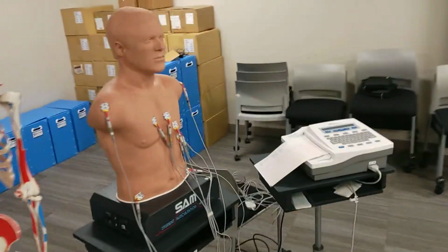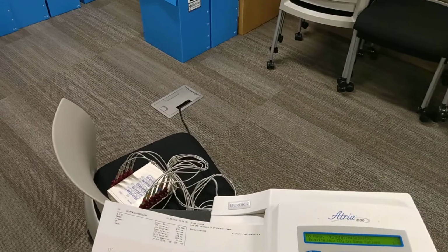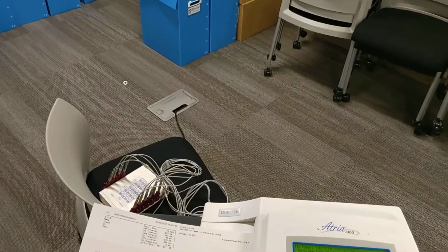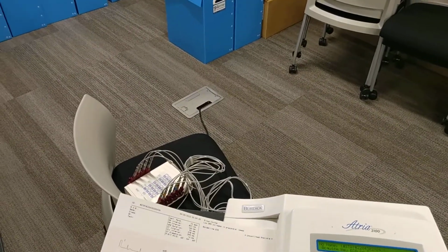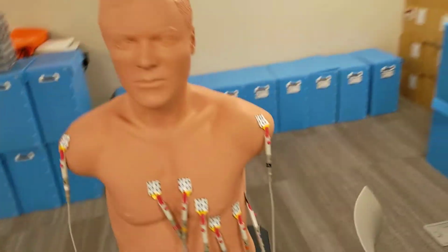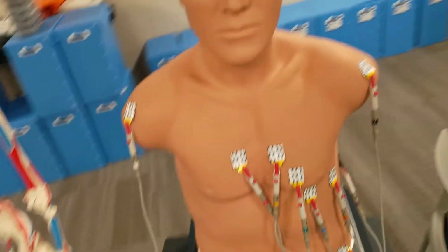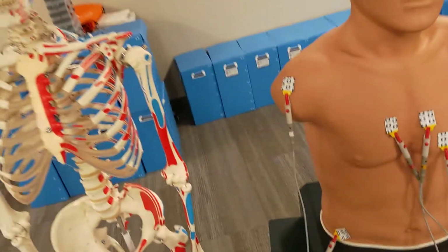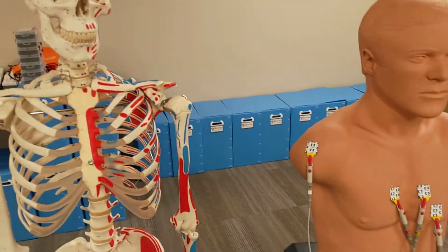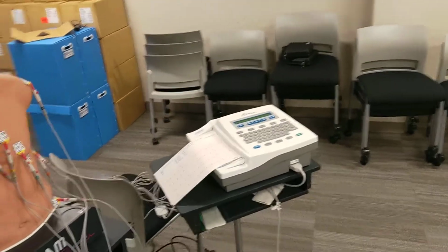As you can see, here is a standard EKG machine with an EKG or ECG printout. It's got 12 leads in a standard format. As you would see it on a patient, the electrodes are placed on the patient's skin. Of course, this is how it would look superimposed there.